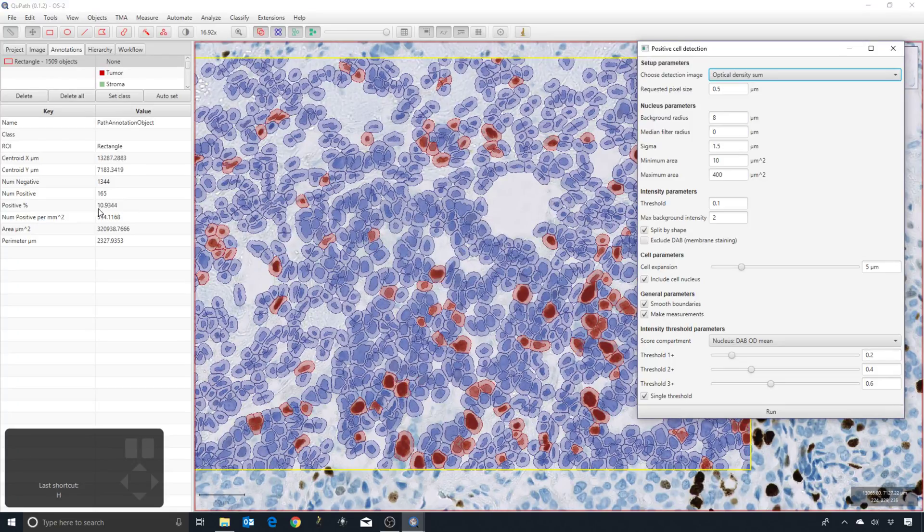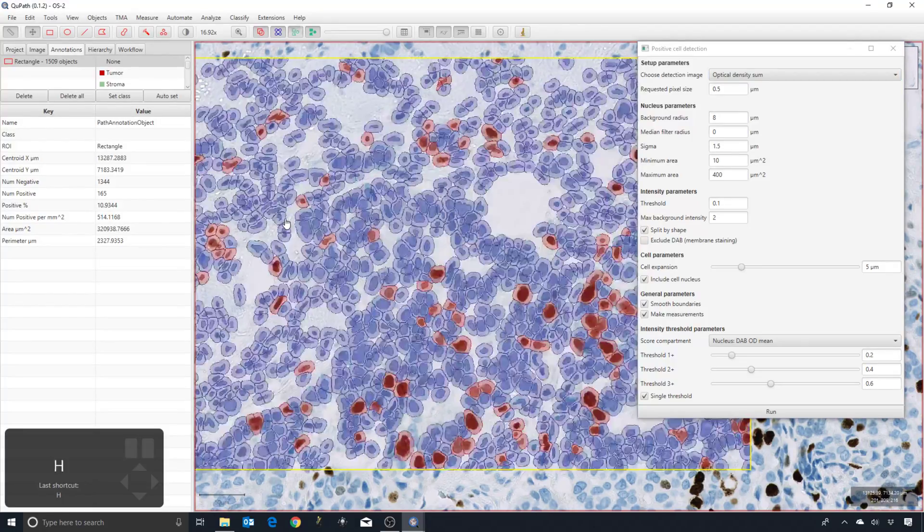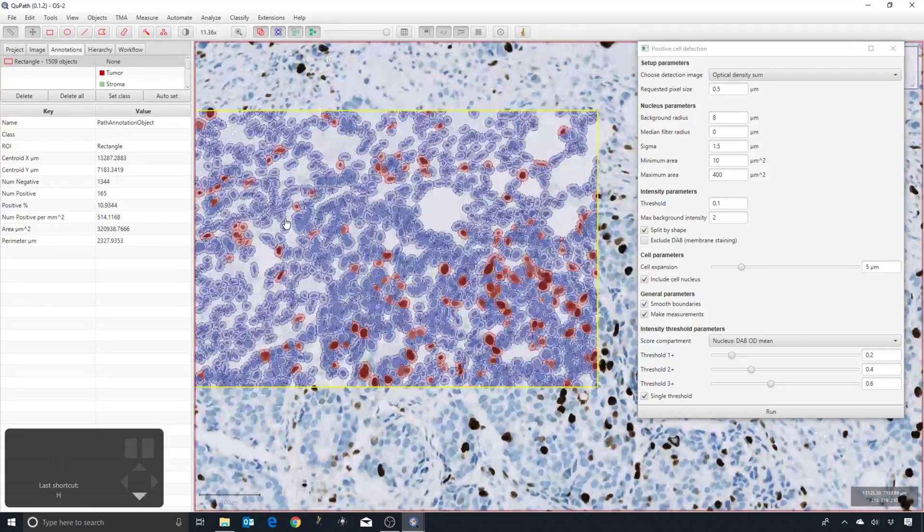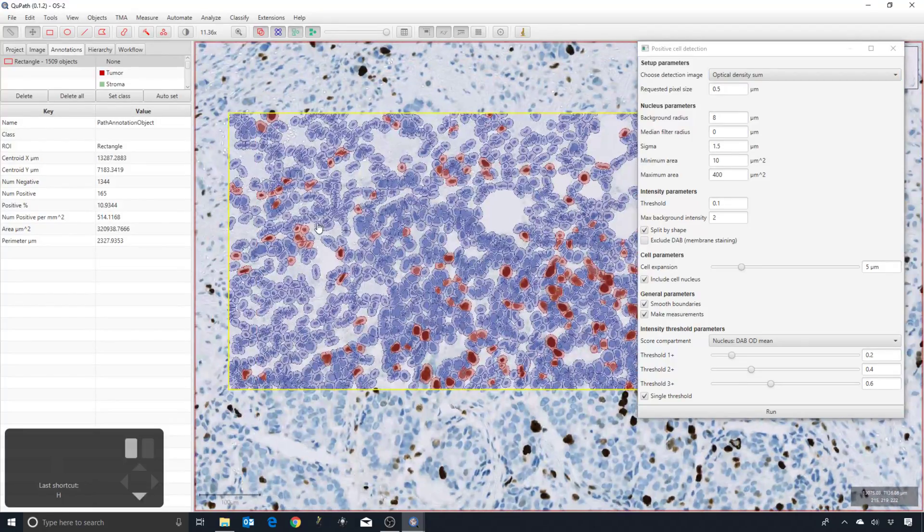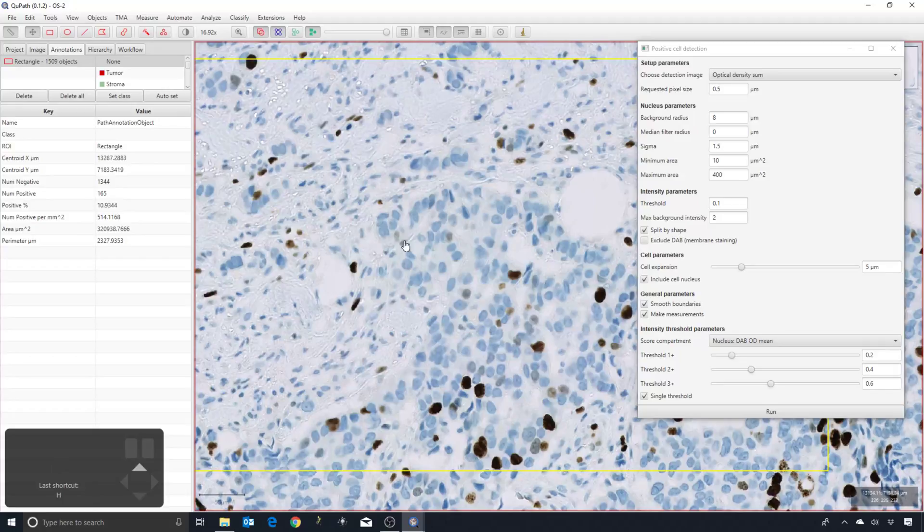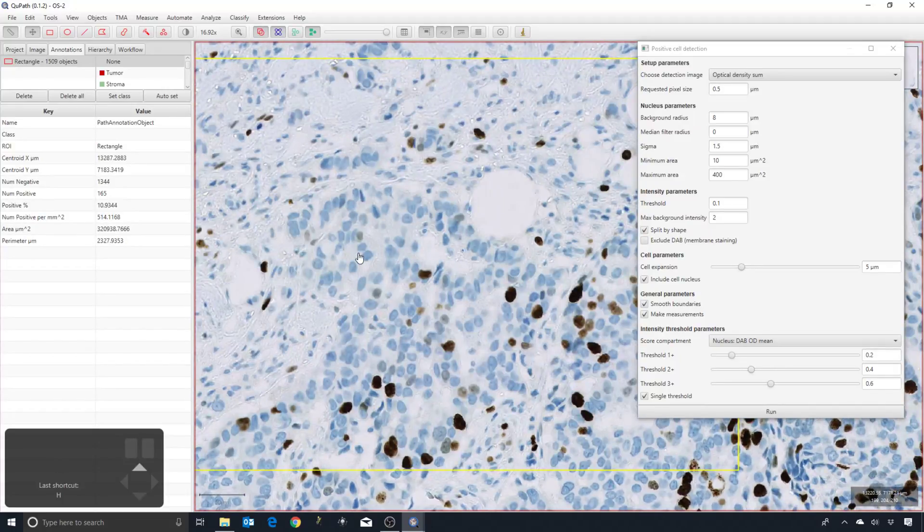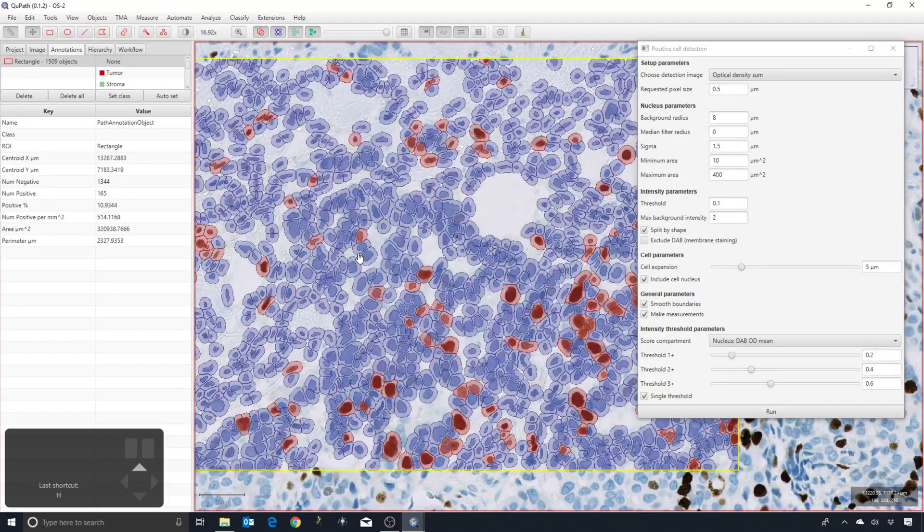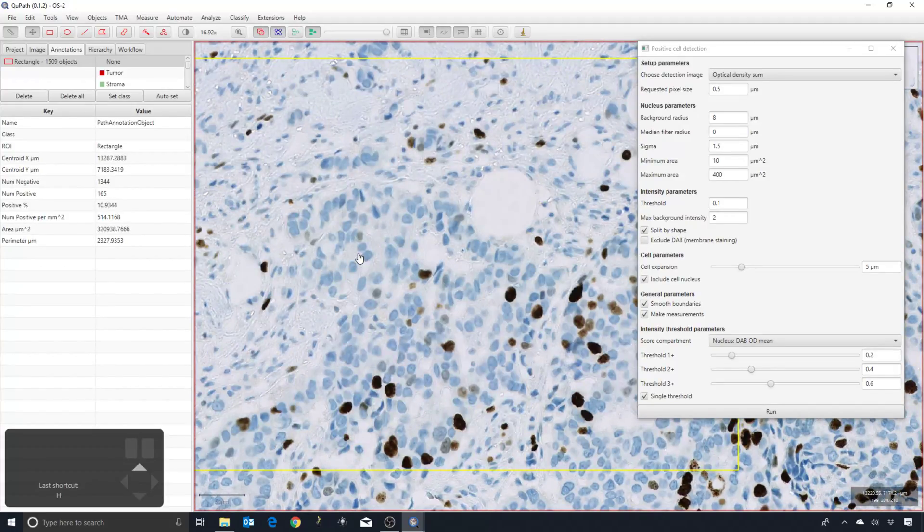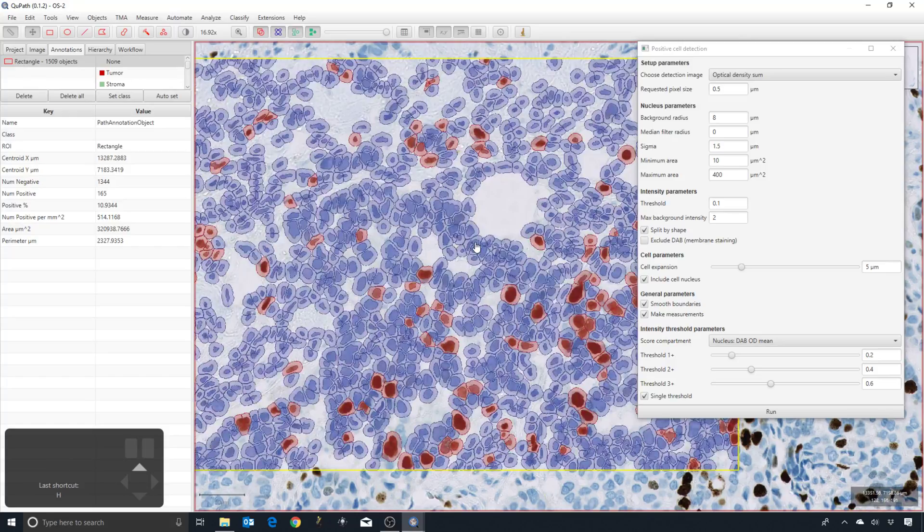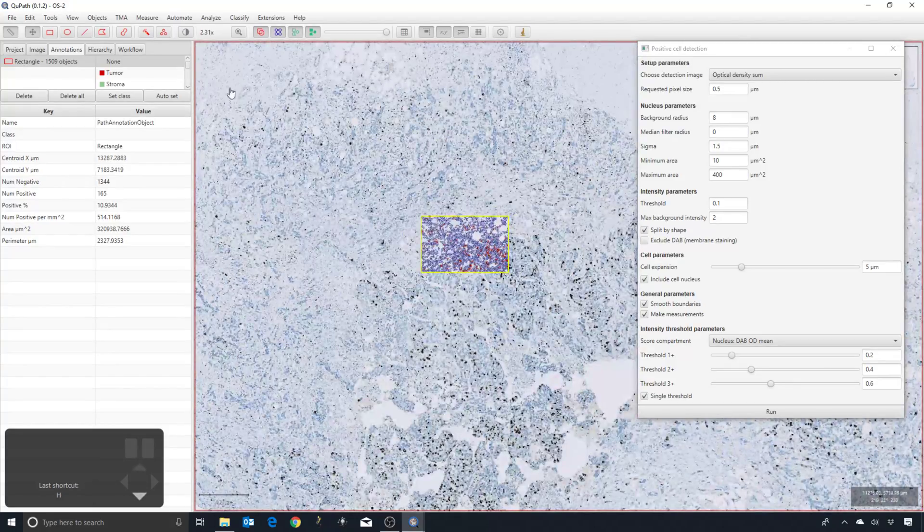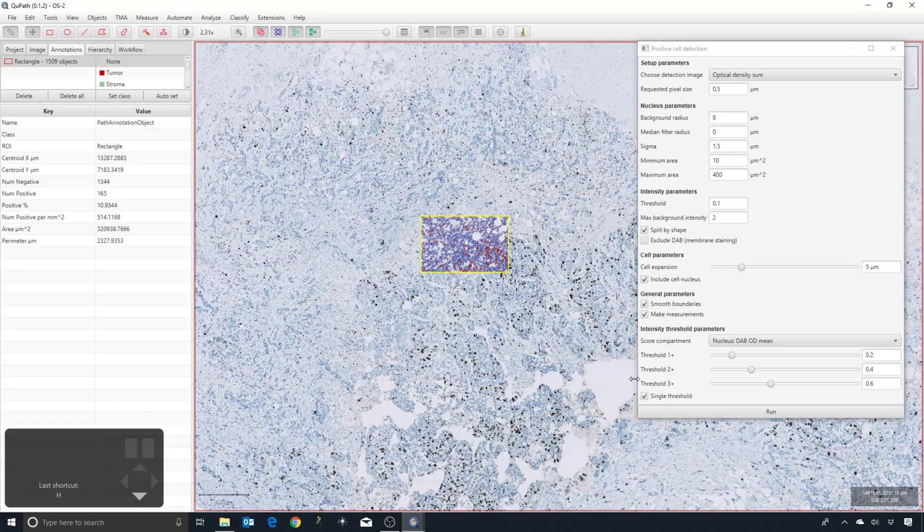Then we get about 10.9%, so it's a 0.3% difference, and so they're very similar results, but they are still different and it may still be worth exploring. But we've got other parameters to look at as well. I would suggest that this means the results are pretty similar. Whenever you run the analysis in a very large region, you will really notice a difference in speed if you run at a lower requested pixel size as opposed to a higher one.